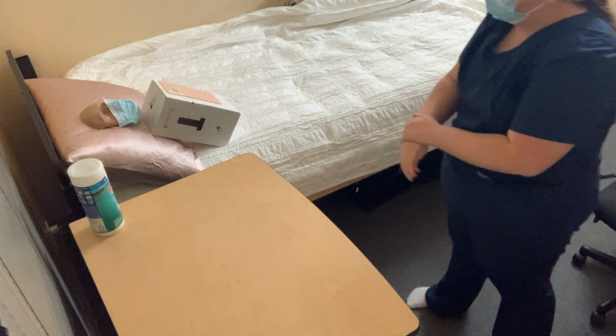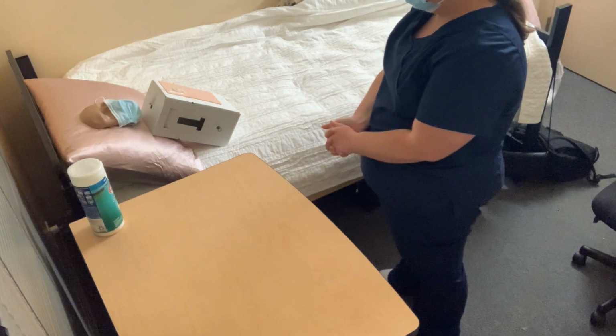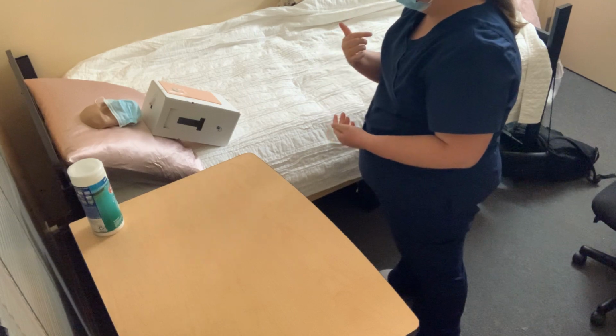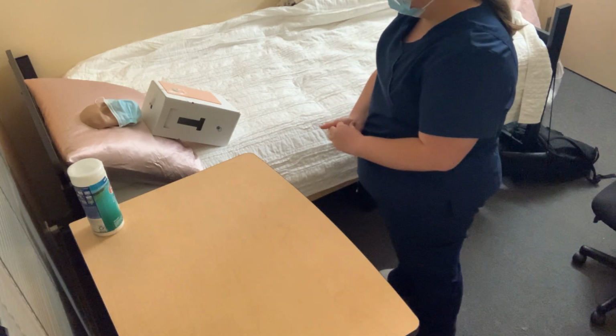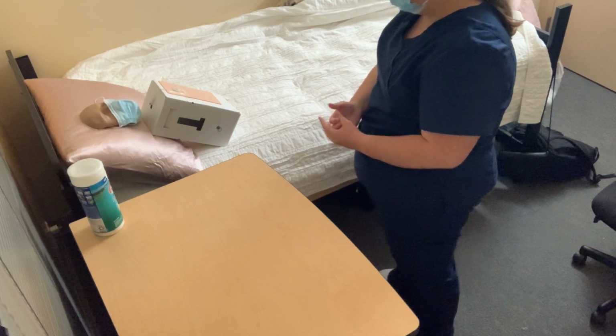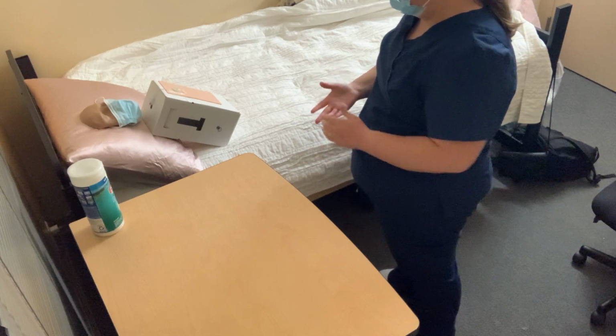Hand hygiene. Hi, Mr. Smith. My name's Kylie. I'm going to be your nurse today. I'm here to change the dressing on your central venous catheter insertion on your chest. Have you had this dressing change done before? You have? Okay, perfect. Do you have any questions or concerns for me about this dressing change today?